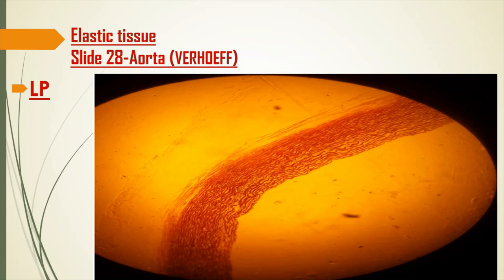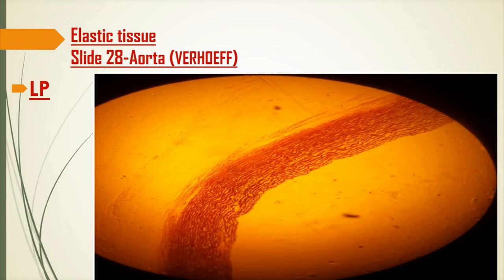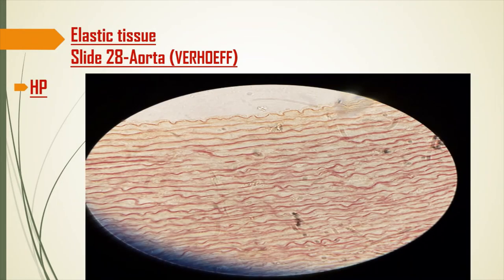At low power, the wavy fibers in the aorta are the elastic fibers. Make this diagram at low power showing the lumen and the elastic fibers. At high power, the regularly arranged wavy lines are the elastic fibers. The lumen is on one side, and beyond that is the tunica media containing the elastic fibers. Draw these at both low and high power.